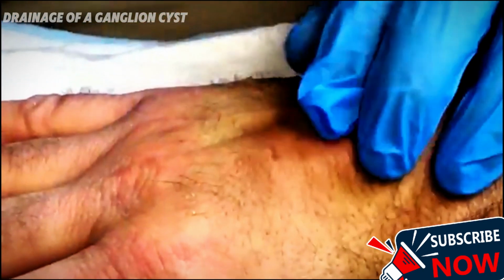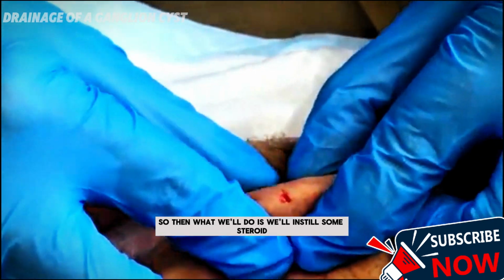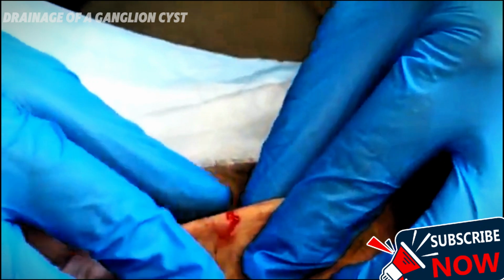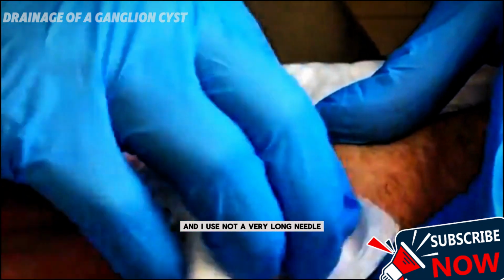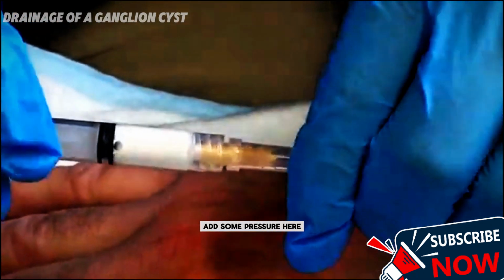Not at all. So then what we'll do is instill some steroid. Now, you do have options here. This is just pure depot Medrol, and I use not a very long needle because you won't need it. Add some pressure here.